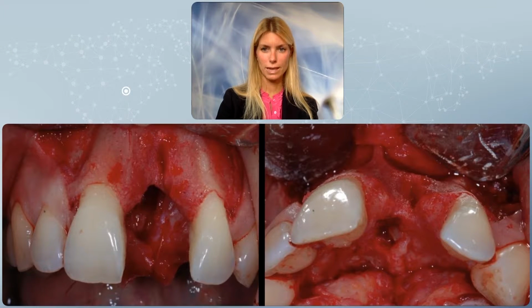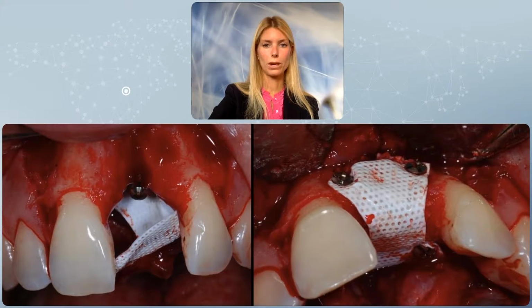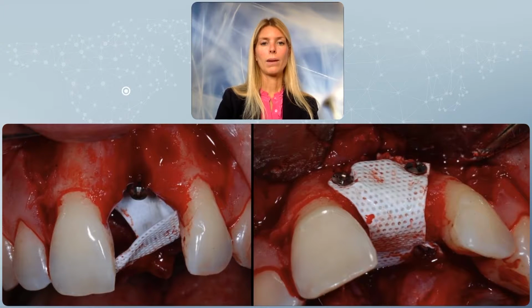You can visibly see the nasal spine, and we are in a highly aesthetic position. We are lucky, though, that the adjacent periodontium is healthy. The clinical attachment levels of the upper right central incisor and the upper left lateral incisor are coherent and healthy. And this will allow us to perform a nice GBR following the bony peaks that we use as our guide points.